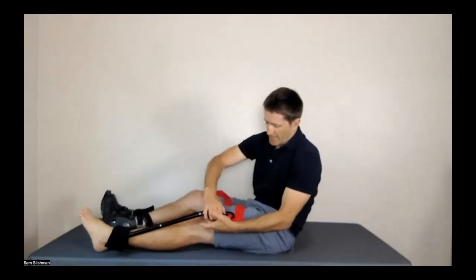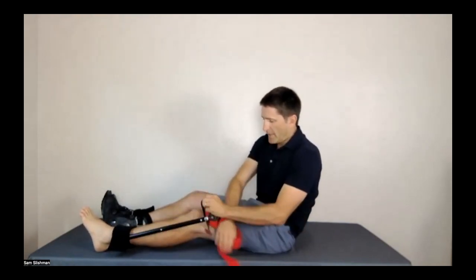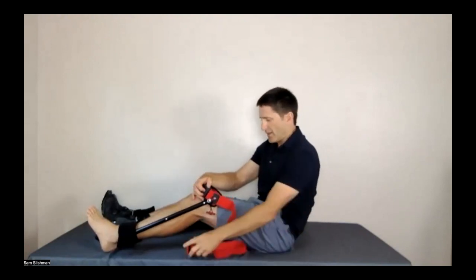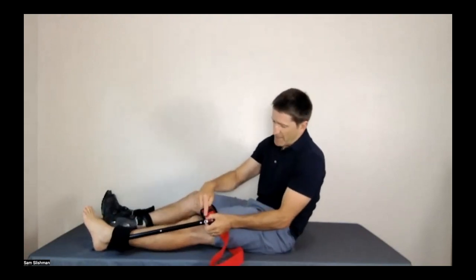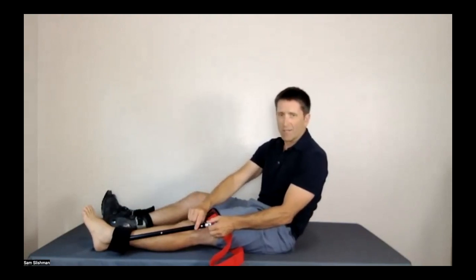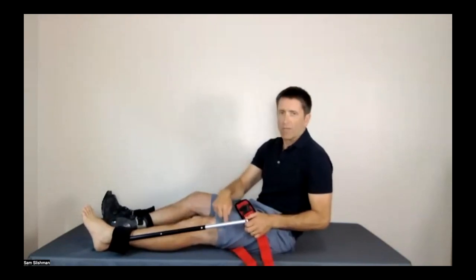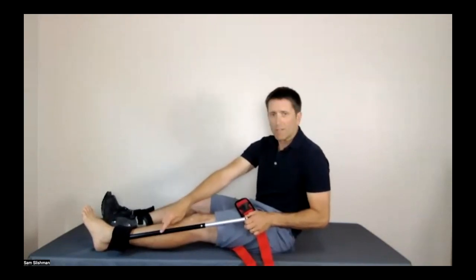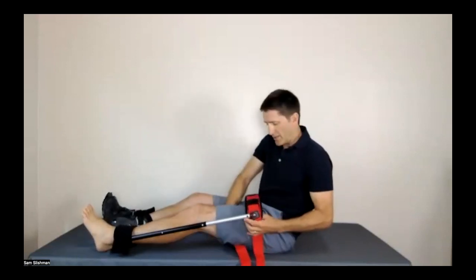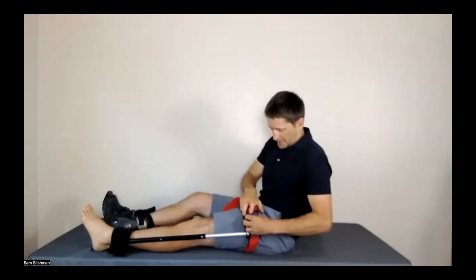And then my next step, once again, I want the female buckle to be anterior to the thigh. But my next step is to pick out how far I'm going to pull this middle silver tube out. It turns out that this works. I can put in the middle spring button hole or the proximal point, and they both work on me. So I'll leave it at the middle point so you can see the mechanism a little bit better.